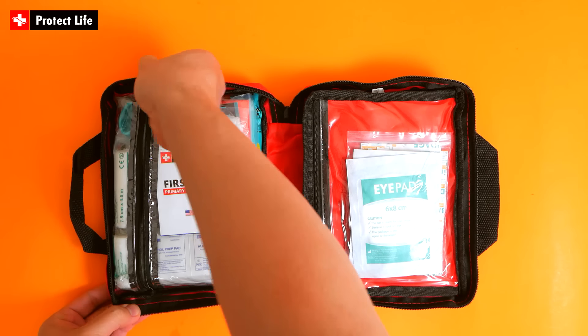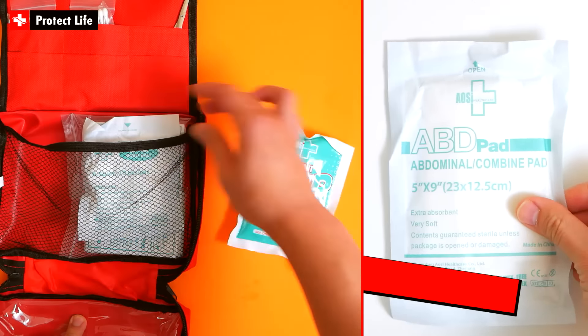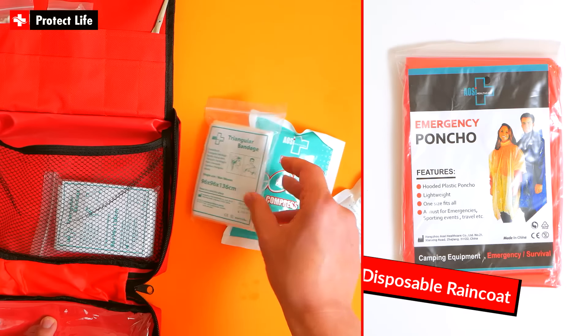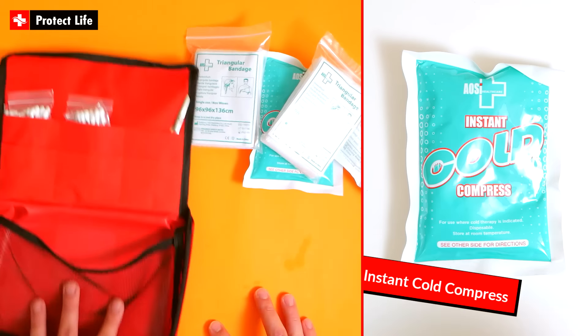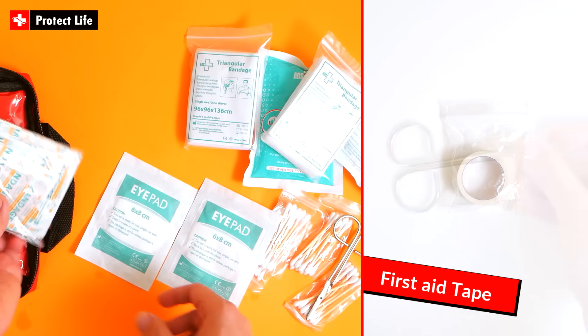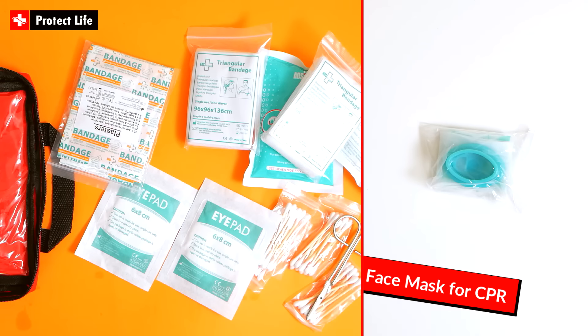You will also appreciate the first aid brochure, which is always handy when you're faced with emergency situations. Just to name a few more items: you get an abdominal pad, triangular bandages, a disposable raincoat, some sterile gauze pads, eye pads, an instant cold compress, one roll of PBT conforming bandage, first aid tape, scissors, tweezers, a whistle, and even a face mask for CPR.